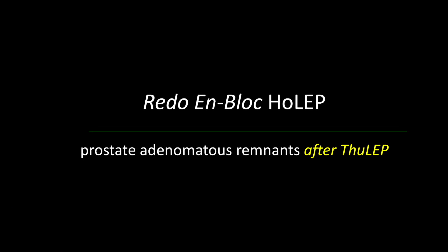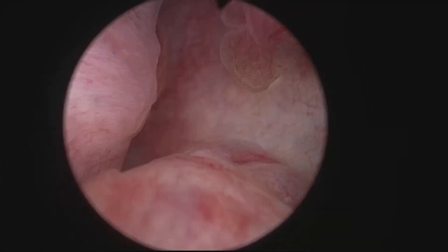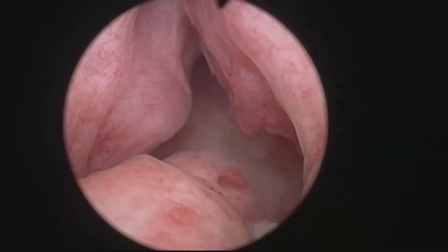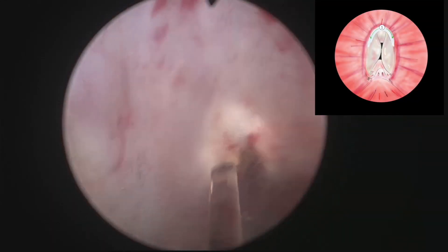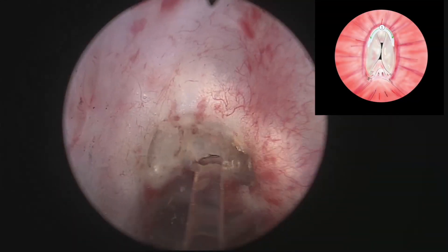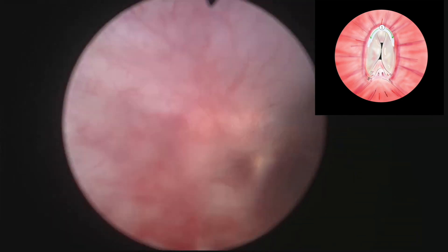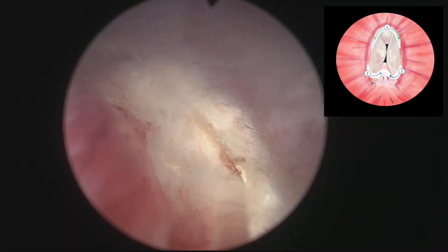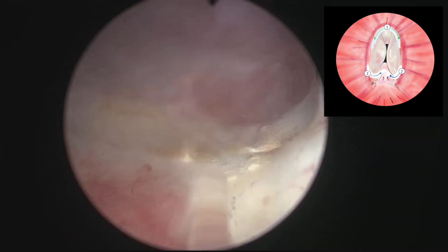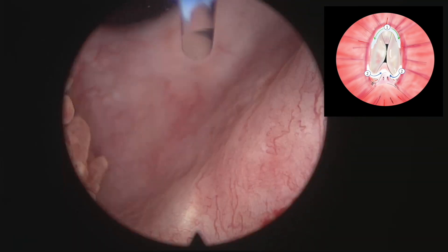This third case is a redo nBloc HOLEP after ThuLEP. This patient was submitted to ThuLEP, which is supposedly able to remove all adenomatous tissue, but in this case, despite there being good cavitation in some aspects of the prostatic fossa, there was residual tissue. Again, this is the circumferential incision carried out cutting the crista urethralis and dissecting the tissue all around the prostate.